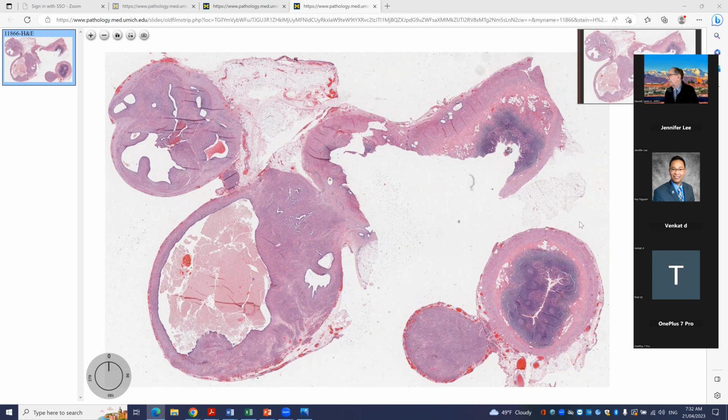I think this was a singular case in my experience to see this sort of process here. So let's go on to case 4. A 30-year-old man who has recently immigrated.